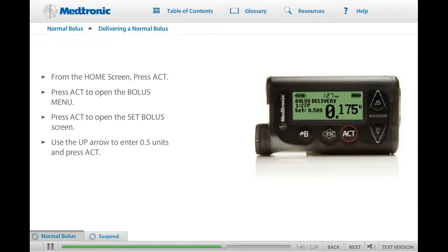Watch the screen as the pump counts and delivers each 0.025 unit. Notice the screen displays the time the bolus was given and the amount that you set. Using your pump, practice programming a normal bolus. Remember, you should not be connected to the pump while you practice. Keep in mind that while a bolus is delivering, you cannot program your pump to perform any other function.